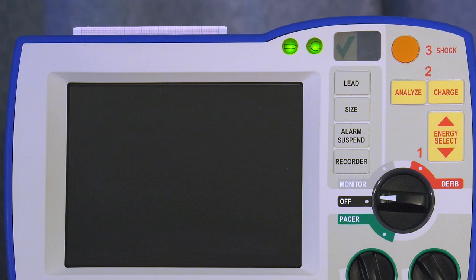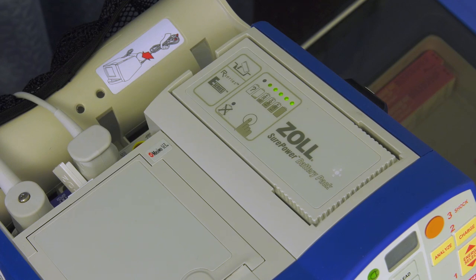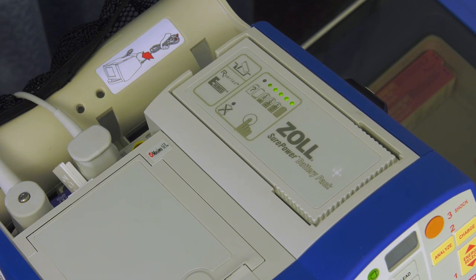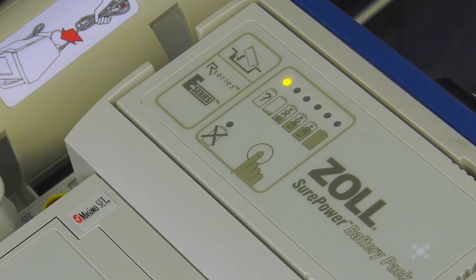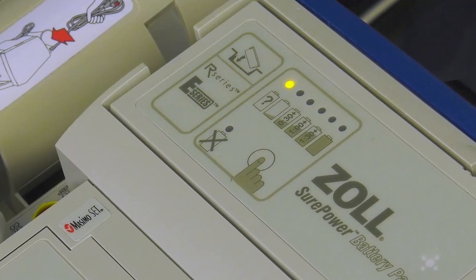A new, fully charged battery will last for 4 hours of continuous ECG monitoring or 100 defibrillation shocks at full energy. The R Series is powered by SurePower lithium ion batteries, which you can easily access on top of the defibrillator. The battery runtime indicator on the top of the battery displays the amount of usable time remaining. To display the status, press and release the display button on the top of the battery. The LED light illuminates from left to right; the last LED to light indicates the remaining runtime. After a year of use, the amber light on the top of the battery will stay lit, which means the battery needs to be reconditioned with biomedical engineering in the SurePower battery charger.